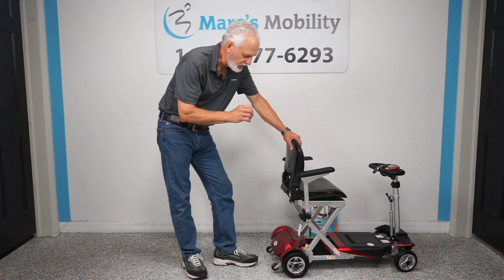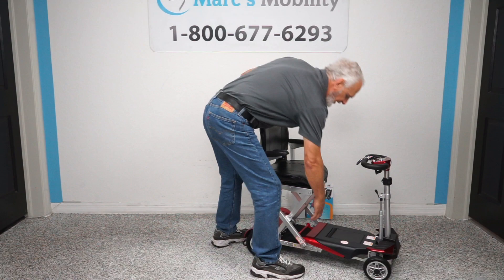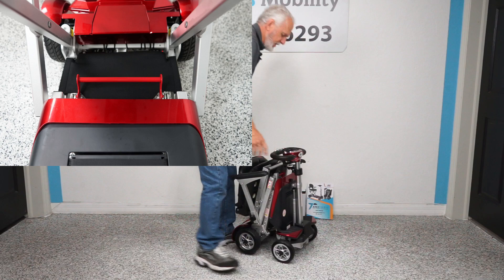Also folks, on this scooter — I'm going to bring it over so you can see a little bit better — there's a red handle here. So if you ever had a problem with the folding, you can fold the scooter manually. If I pull the handle here, I can fold the scooter manually. So that's your manual fold right there, and now we're back locked into gear.